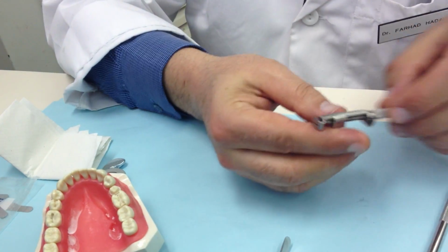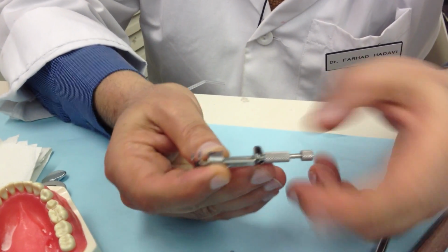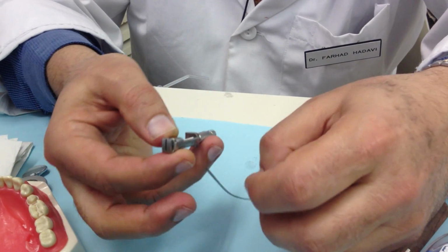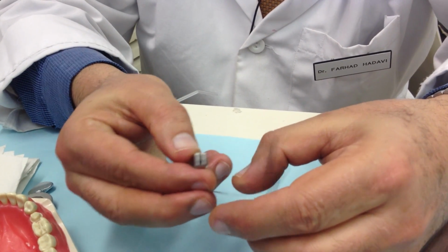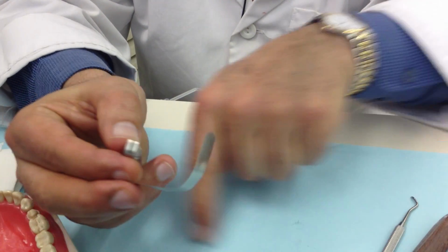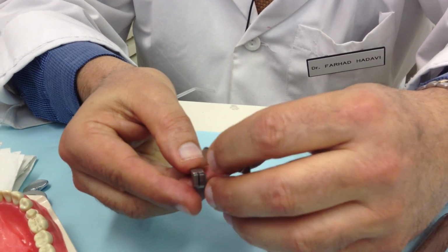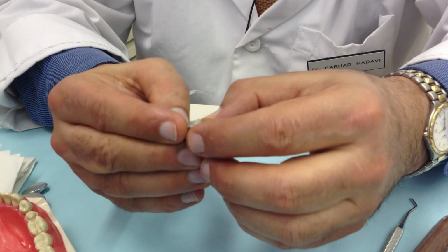Now, if I want to set this one, what I do, I bring this one, you can see by turning that one, this comes all the way up. Correct? This is the large knob. Now I know that a small circumference should be toward the gum. I know this should be toward the gum. So, because of those two equations, a small circumference should be toward the open side of the head, correct? Now I place this one. I know that this side is going toward the gum.